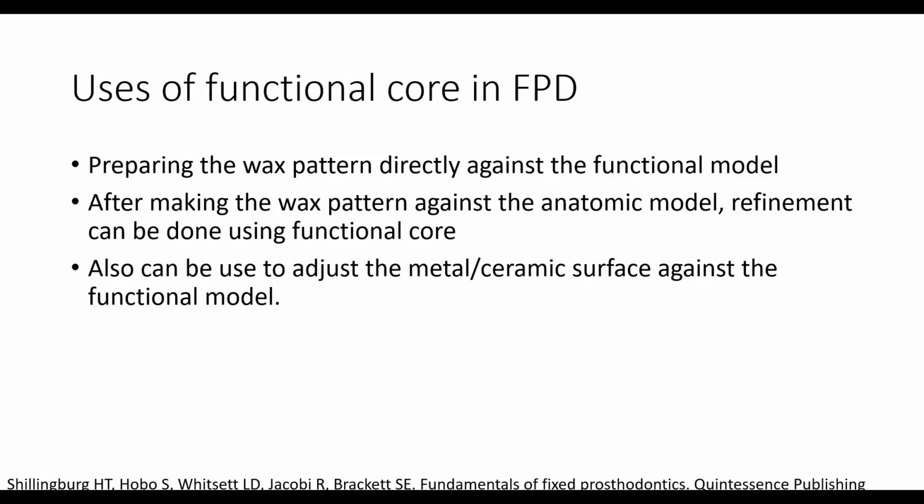Now coming to the use of the functional core in FPD. The wax pattern can be prepared directly against the functional model. Also, after making the wax pattern against the anatomic model, refinement can be done using the functional core, and it can also be used to adjust the metal ceramic surface against the functional model.